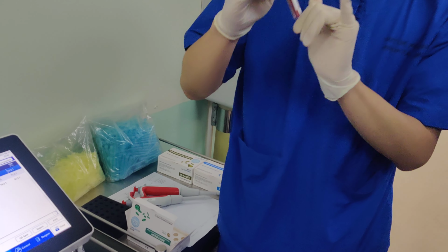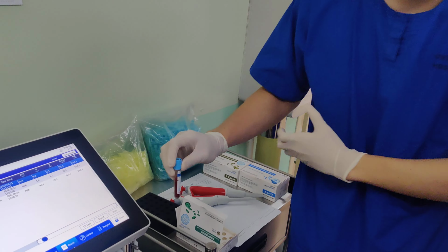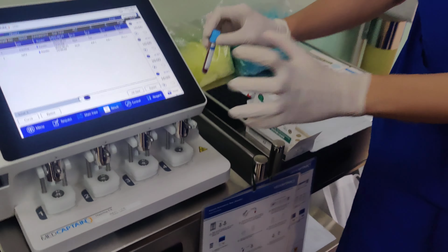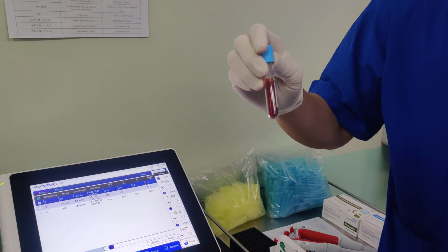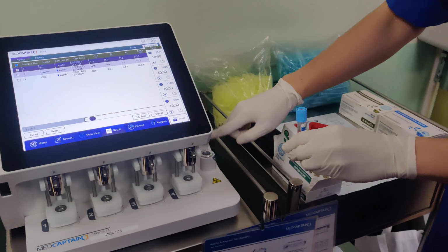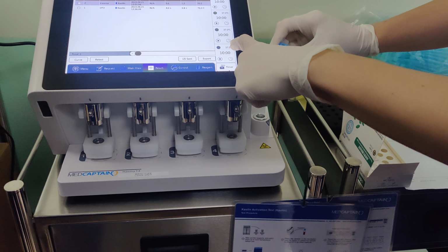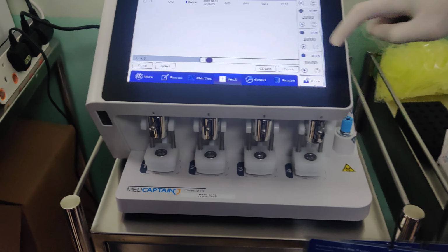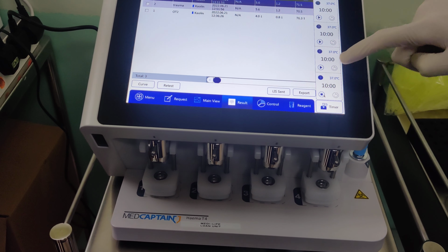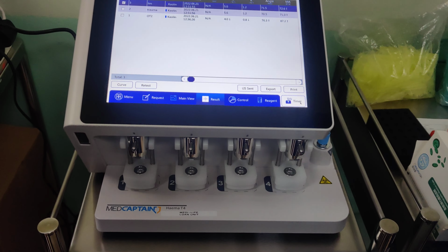Update center, ini dari ICU lah. So since it's dari ICU, not too far, we can actually run the test immediately. Tapi kalau dari ward, kita takut blood dia akan cool down, not body temperature anymore. Which is why machine ni dia ada incubator lah, incubator to make sure that it's 37 degrees. So how to activate? Kita masuk ke dalam slot, kita tengok slot 1, kita start at 1. So this will keep it incubate at the 37 while we prepare everything.